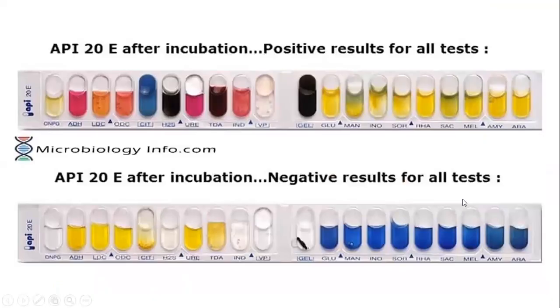First of all, you should know how an API kit looks when all the tests are positive and when all the tests are negative. Just look at the upper portion, the API 20 after incubation, where all the tests are positive. For example, there is a special type of microorganism giving all the tests positive.